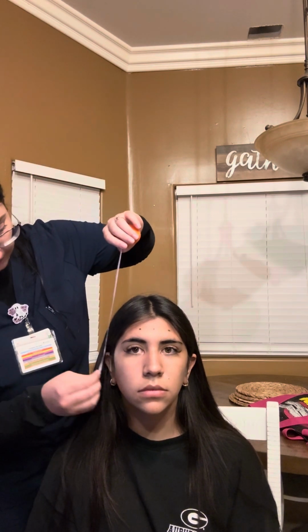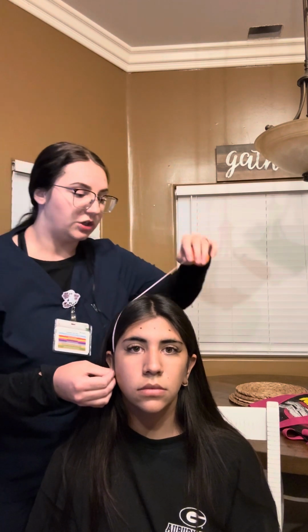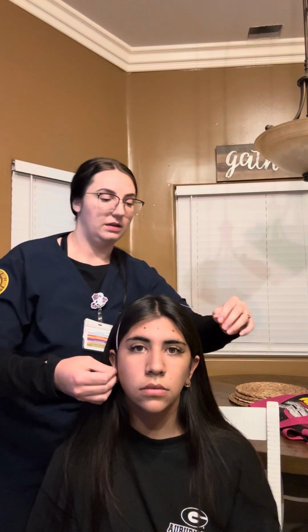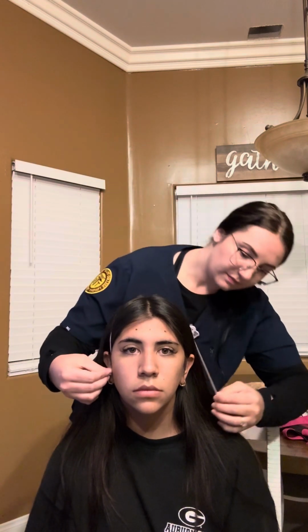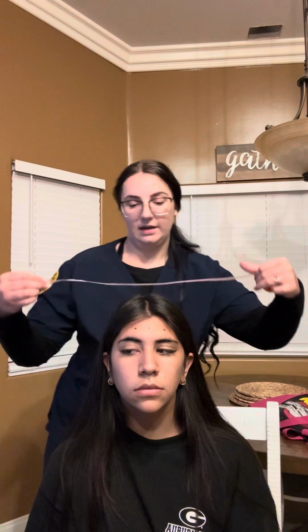Secondly, I'm going to do the preauricular to the preauricular, hope I said that right. We go from around the tragus, and you make sure you hit that CZ for it to be accurate. You meet it on the other side, where I made little dots you can't really see, and the measurement I got was 37.